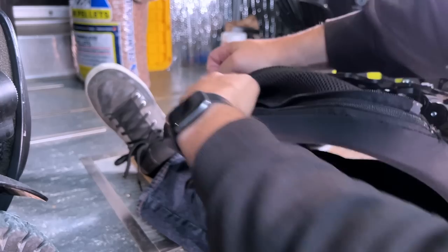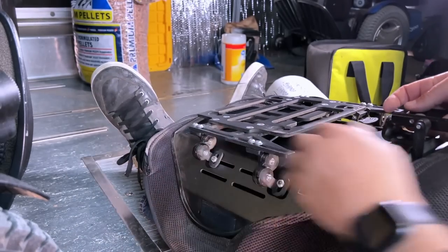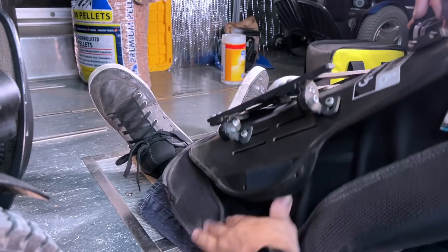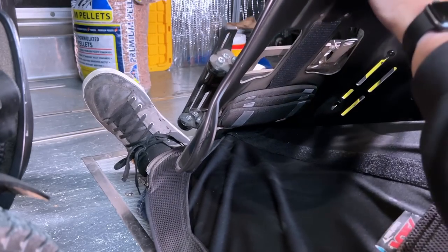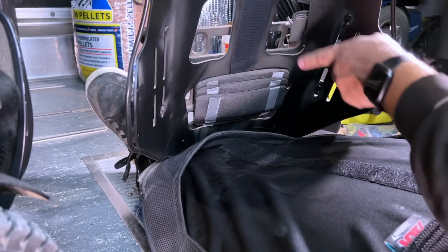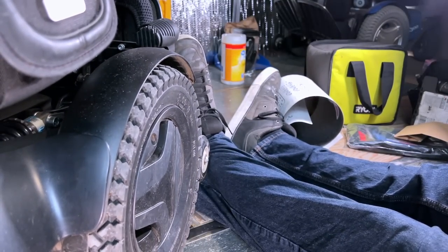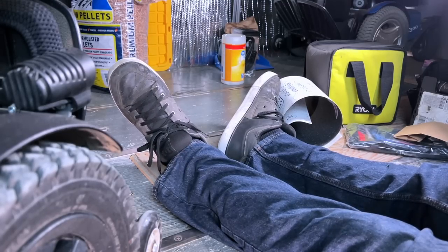Look at that dust. It has finally started raining here in Portland, so we should be switching over to mud flying through the air instead of dust. It looks like our little strip has come off of here too. There are some foam pads in there — did not know that. You have to be careful when you pull some of this off because this Velcro, while it is glued on, can very easily become detached. Also, make sure your chair is off when you do that — I just saw my chair start driving. Power is off.